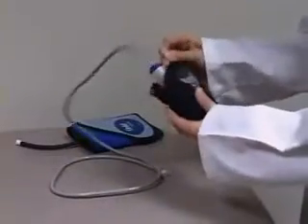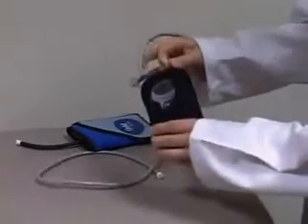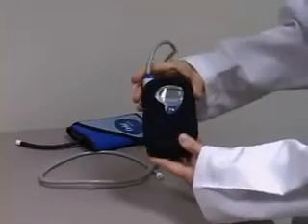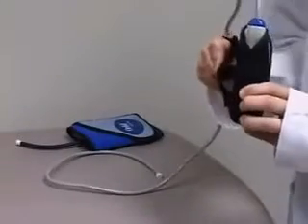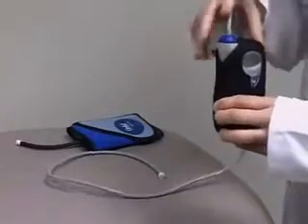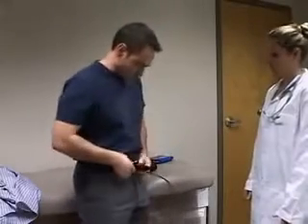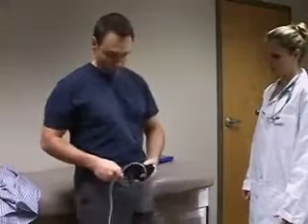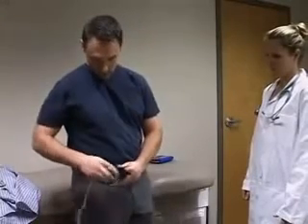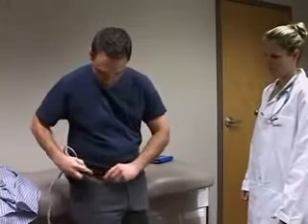To begin, place the Oscar II into the provided pouch as shown. Be sure to zip the pouch closed with the air hose exiting from the top. A belt loop on the rear of the pouch allows the patient to wear the device without interfering with normal activity. Be sure the Oscar II monitor is securely fixed to the patient before proceeding.